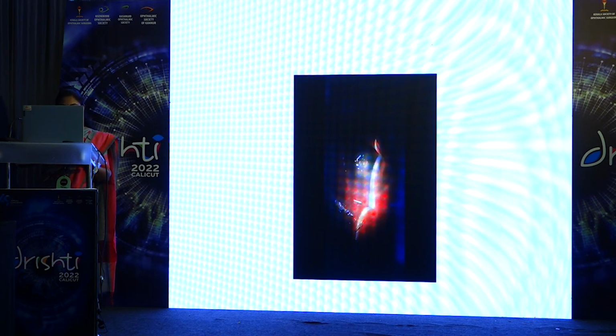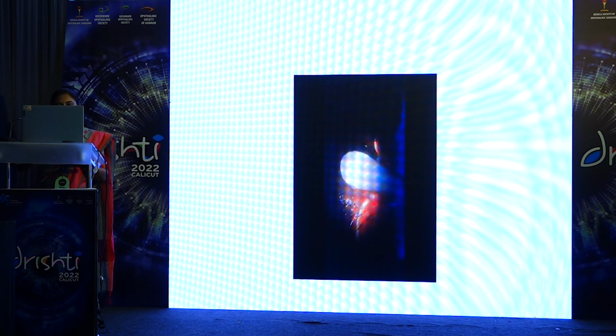Now this is the video. Initially, you have to use a sterile cotton bud. This is to remove any debris lying on the surface of the infiltrate, or to remove the excess local anesthetic or tear that is there, so that you get the proper base on which you will do the scraping.